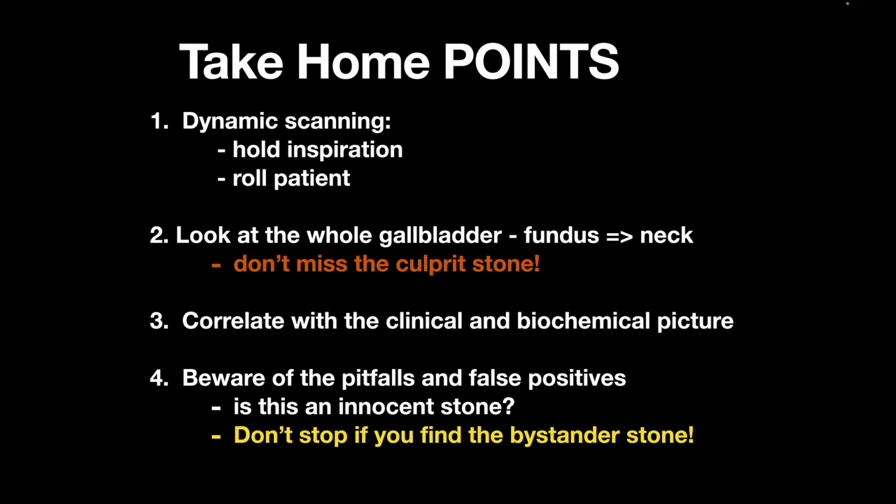Take-home points. Gallbladder is all about dynamic scanning, so ask the patient to hold their breath. Take a deep inspiration as long as possible to get a good window to see the gallbladder. Look through the ribs as well. Roll the patient if you're not sure what you're seeing, or if you need to get a better view, or you want to see what's going on with those stones.